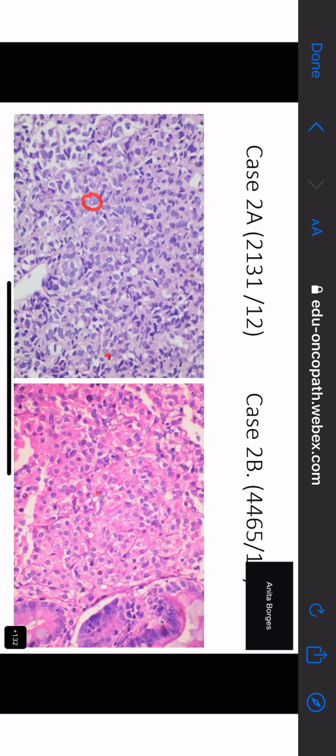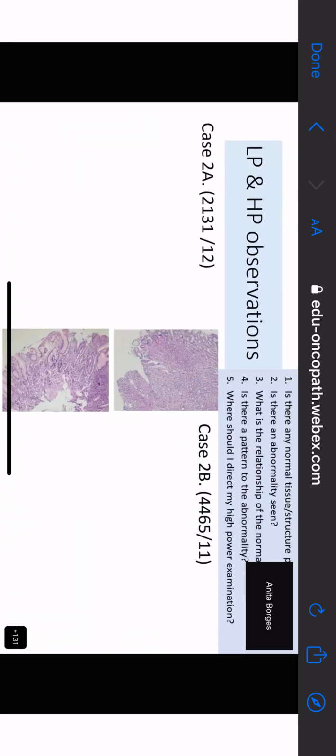All right. So now, what is the diagnosis? Come on now, Sumeta, you have to do case 2A. Is there any normal tissue?